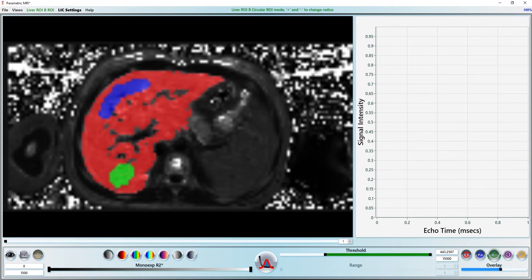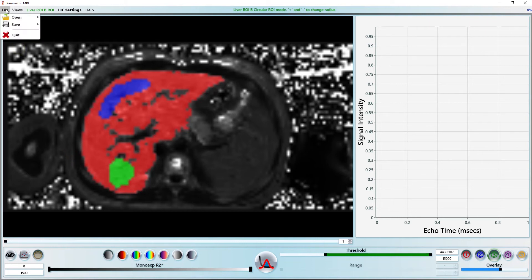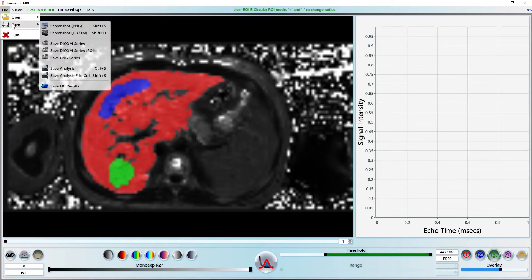At this point, we can save the analysis and generate an LIC report to send to PAX. Let's save the analysis by pressing CTRL-S on the keyboard. You can see the star disappear from the top left corner signifying that our progress is saved. To generate a report, select Save LIC results from the File Save menu.